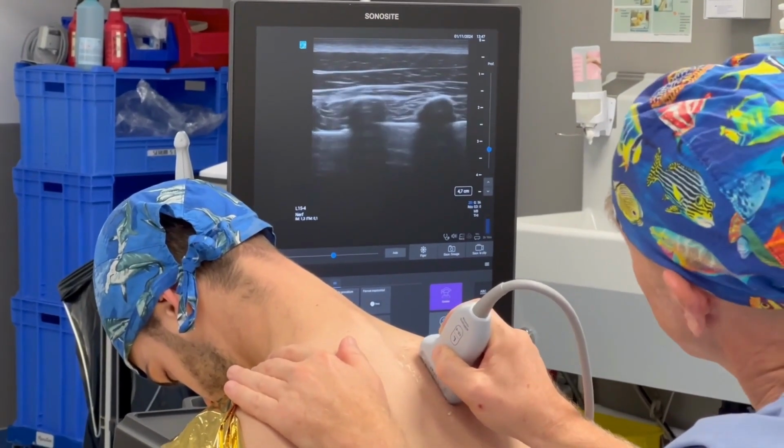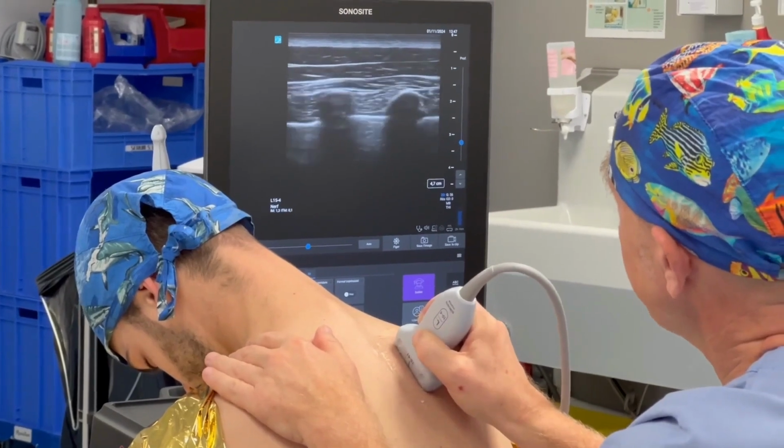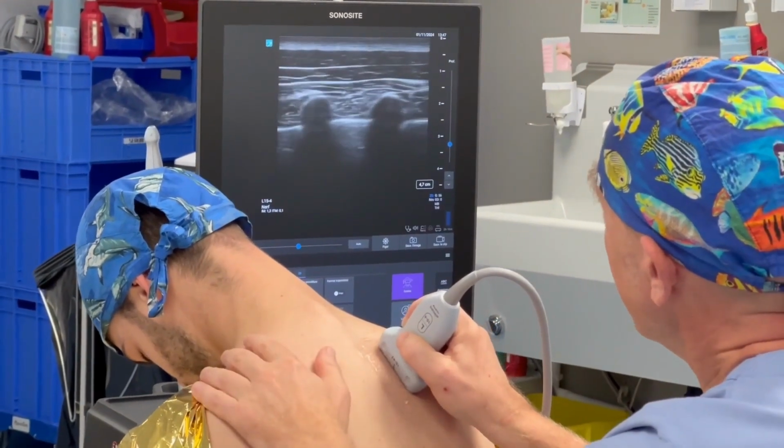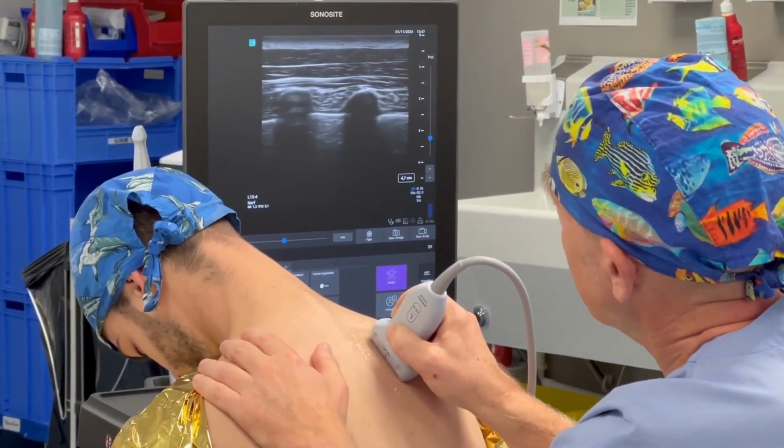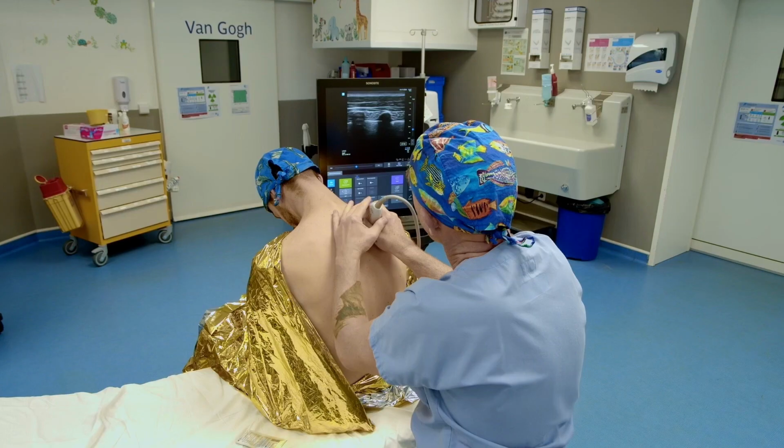which are between the two bony landmarks, and can have different names depending on the level you're at. Strictly speaking, it's mainly this aspect of sonoanatomy that's important, and the injection site. So you see like this. Now a small clarification.